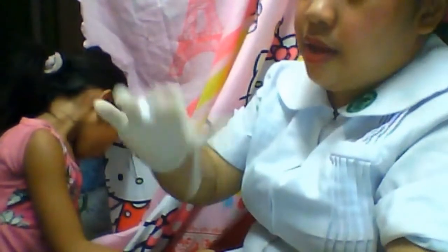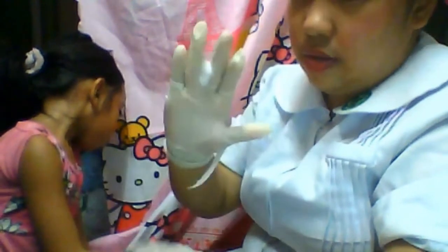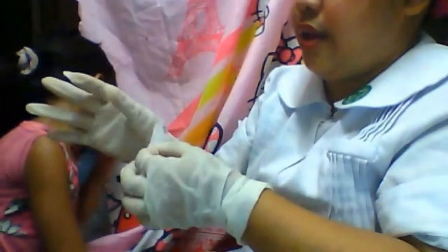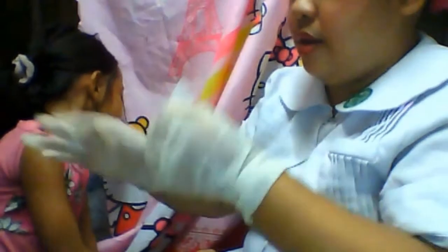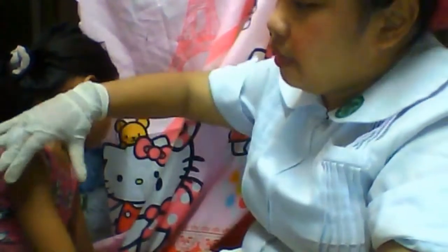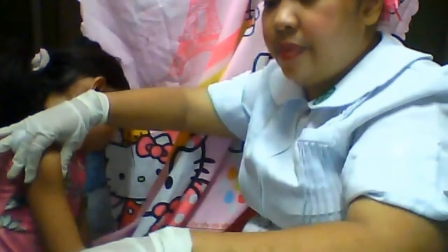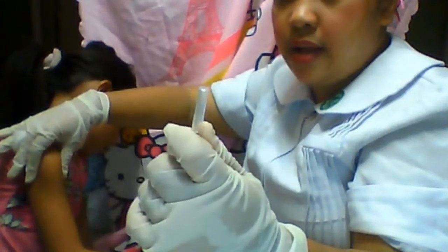That way. So we do that. Some would actually do this, like that, and some prepare this one. So again, like that, we let it air dry. We get our medication using a one-hand technique.